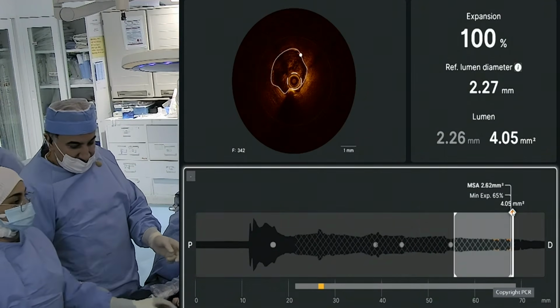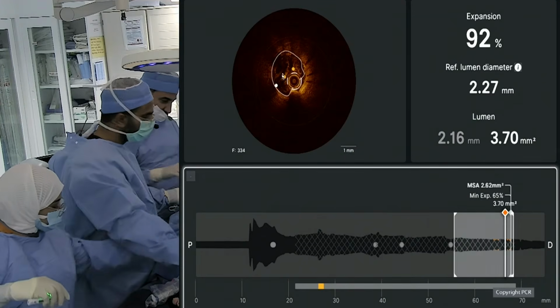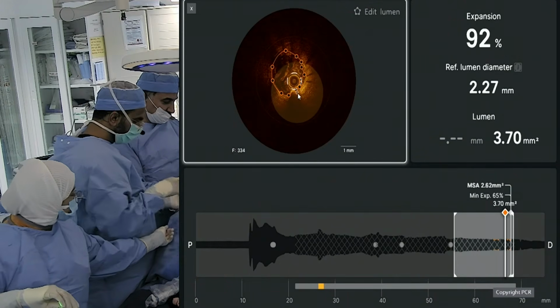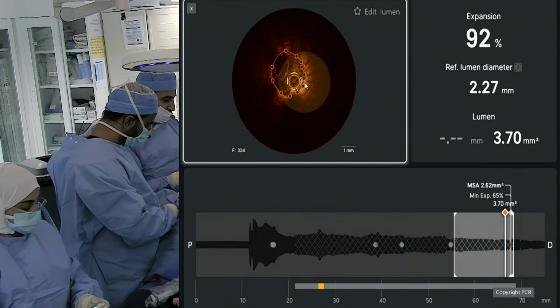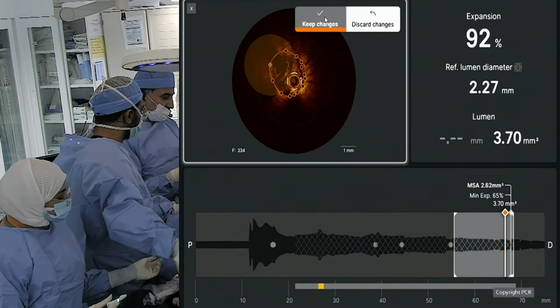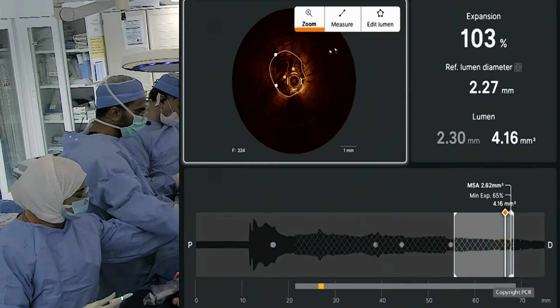Okay, another point is that distally, with a 3... at this point you have a blood contamination that is making the calculation perhaps wrong. So you can see the blood inside, and then you needed to adjust to have the right measurements of the lumen. Mm-hmm. So I think you're making really good points to make the best out of the images, and not everything is fully automated, particularly if there is blood. But we're watching you, and we understand you're happy with the result as it stands.